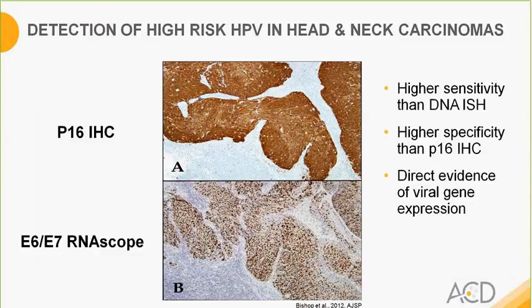The last application that I wanted to highlight was in the field of so-called head and neck cancers, where RNAscope assays for the human papilloma virus are proving to be very valuable for the characterization of squamous cell carcinomas. Numerous studies utilizing the RNAscope technology, as well as other markers, have shown a difference in the behavior and aggressiveness of HPV-related squamous cell carcinomas relative to non-HPV-related tumors, which are thought to be related to smoking and/or alcohol exposure.